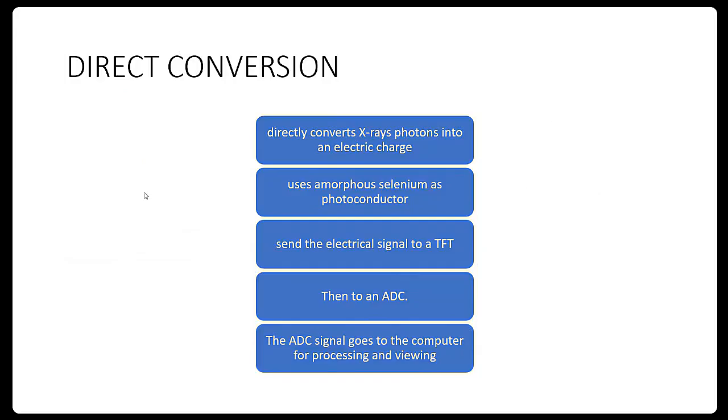So why are we using these elements? Because all these elements have a high intrinsic spatial resolution, and as a result, the pixel size, matrix, and spatial resolution of direct conversion detectors are not limited by the detector material itself, but only by the recording and readout devices used.